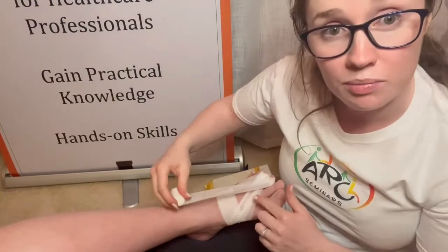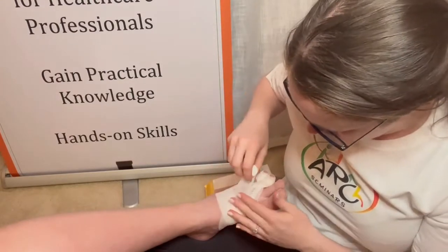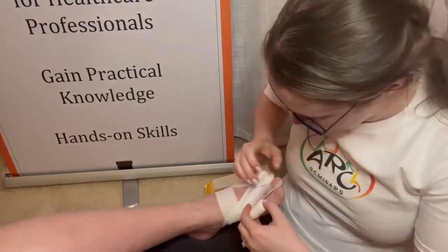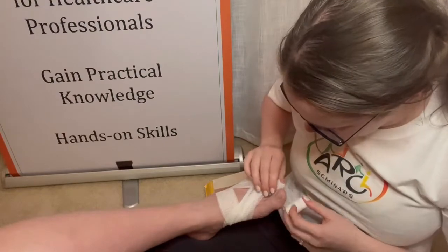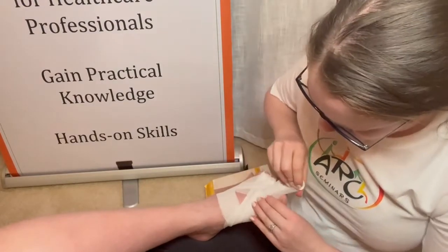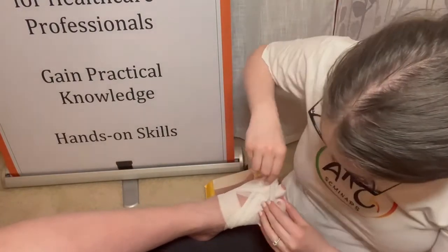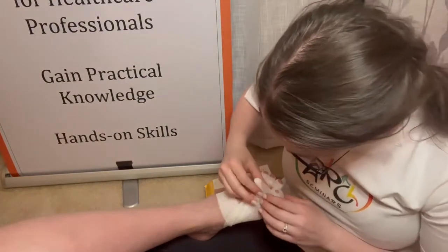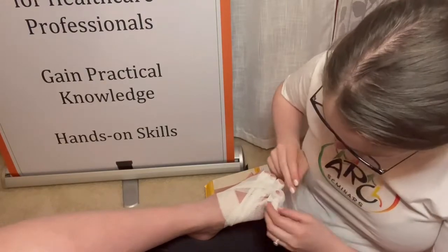So I've done my 2nd toe here. I'm going to bring that diagonally around again, anchoring in a slightly different location, and back around the foot, where we go to our 2nd toe here. At this stage, the gauze is long enough that it does not need to be doubled over for this longer digit. Go around 3 times, back again, and up to the great toe. As you can see, I'm really focusing on the top of the toe. This is going to help the bandage stay on. It's going to be more comfortable for your patient, which is crucial because if it is uncomfortable for your patient, they'll be taking it off and all of your beautiful work will be for naught.